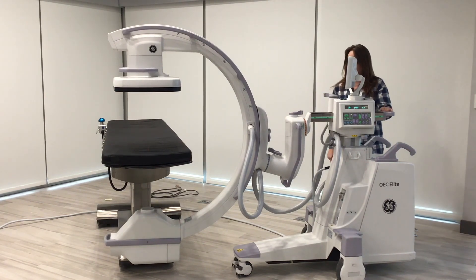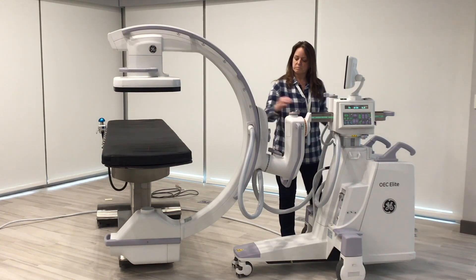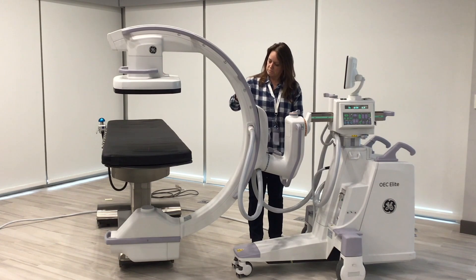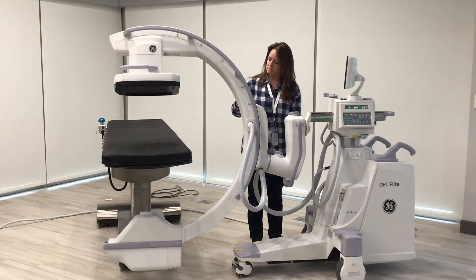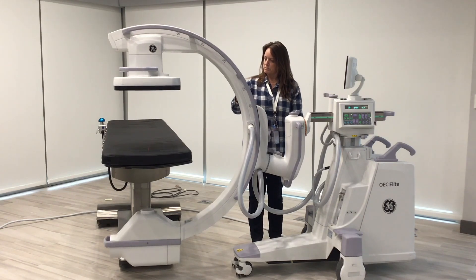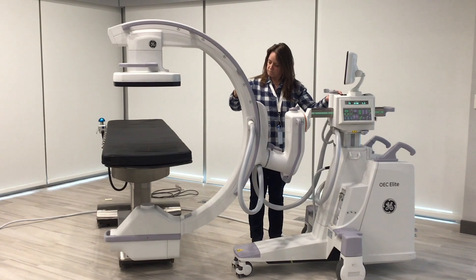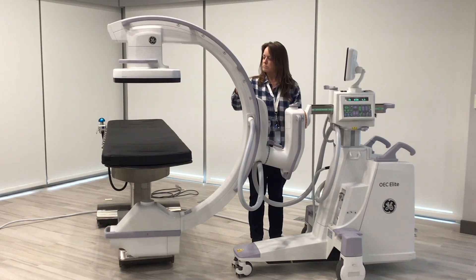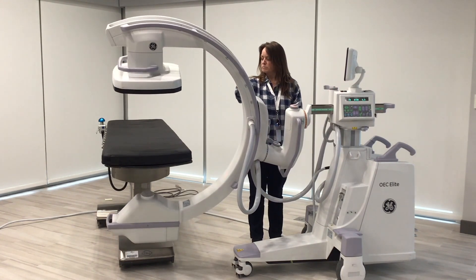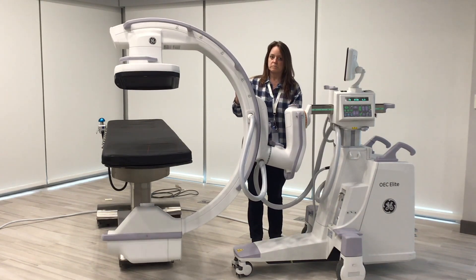Another one that's very helpful, especially in spine procedures, is the orange brake, which is our cranial caudal lock. It's really helpful when you're trying to position in spine procedures and line up end plates, or get the pedicles lined up in certain ways — whatever the doctor would like to see, whether you're working with a superior or inferior end plate. You can also raise the C-arm up and down to give more cranial tilt or more caudal tilt.